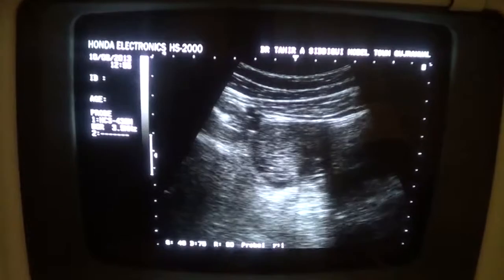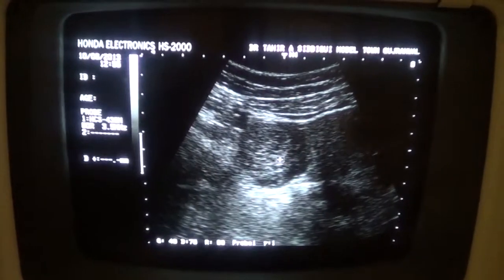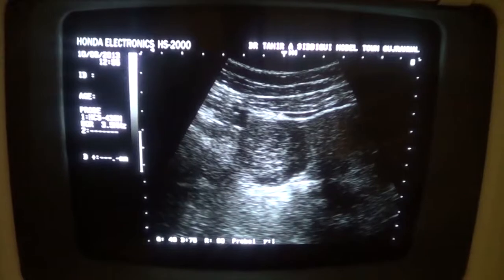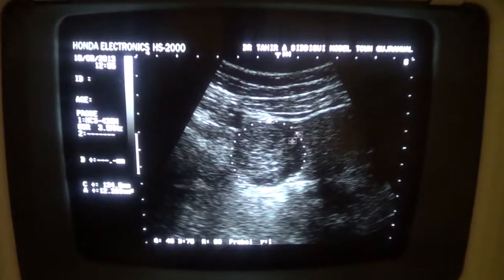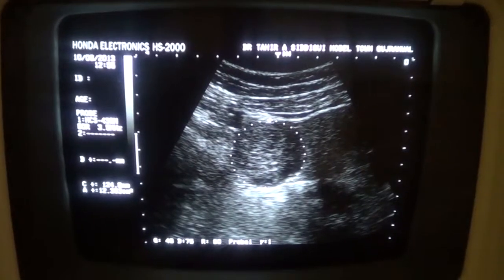This is the cystic area under study, and you can see there are multiple tiny cystic areas within this echogenic area within this cyst. Now the cyst basically is, here is the cyst. There is fluid in its medial margin. Now you will feel the difference.